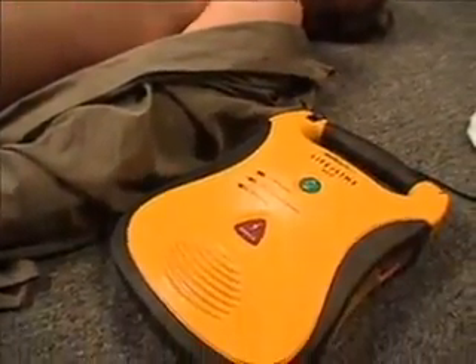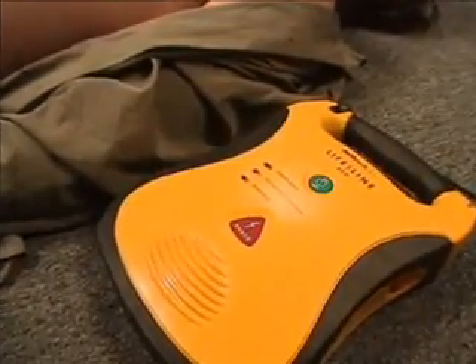Once you've determined that the victim needs treatment, start by turning the Lifeline AED on. To turn the unit on, simply press the on-off button.